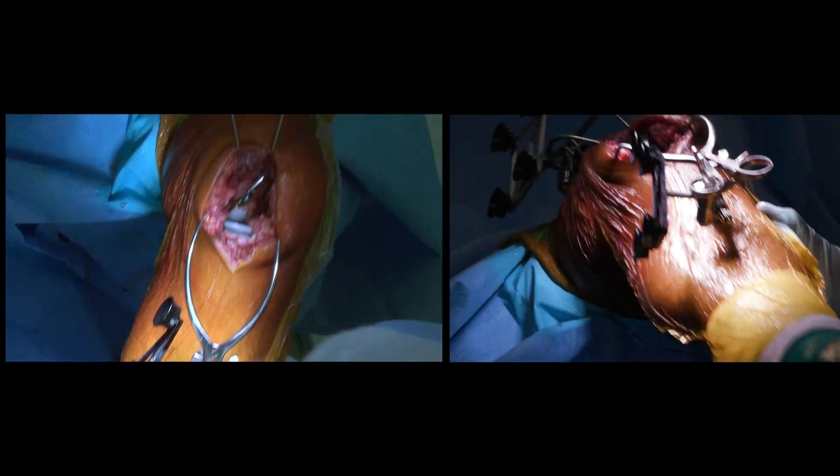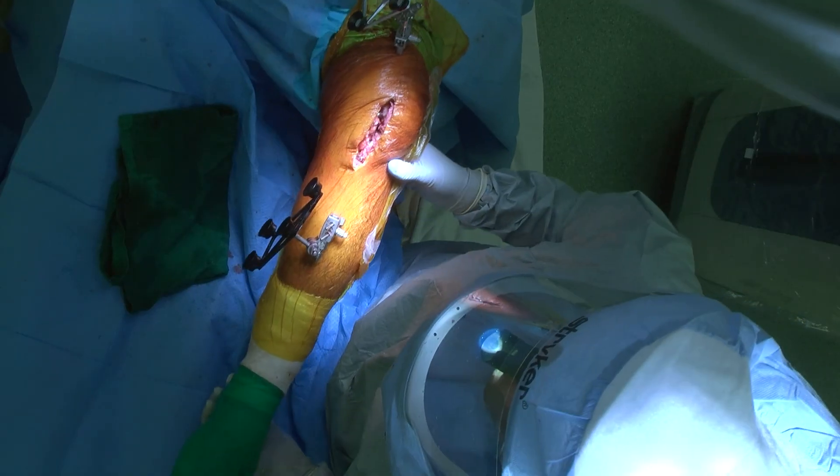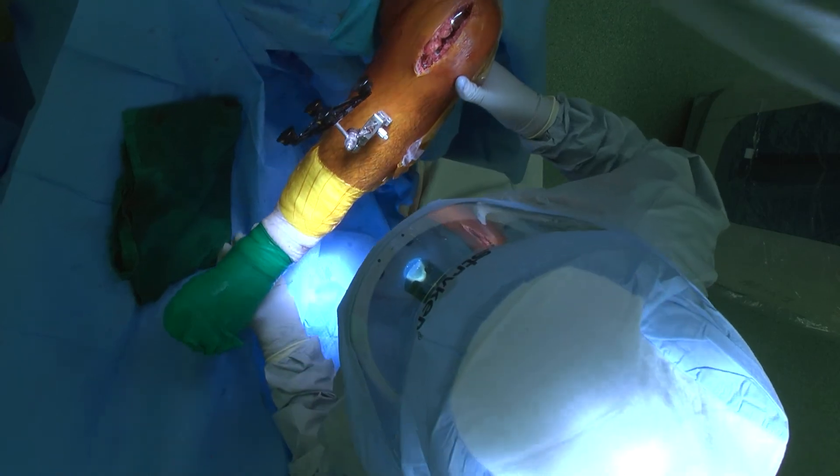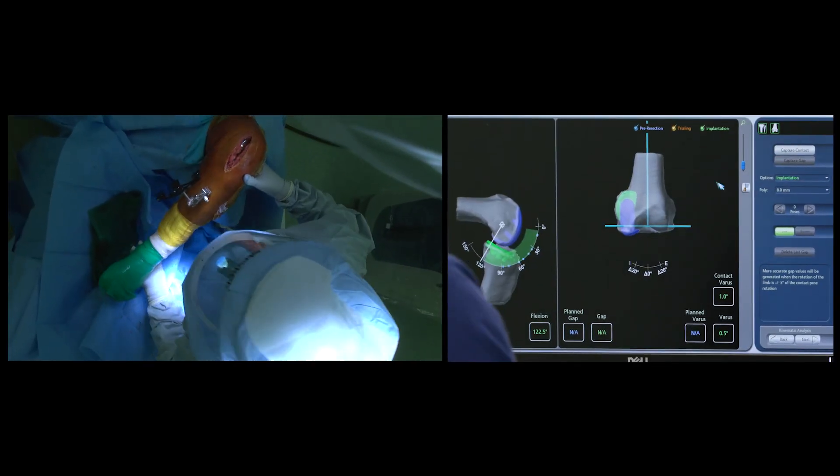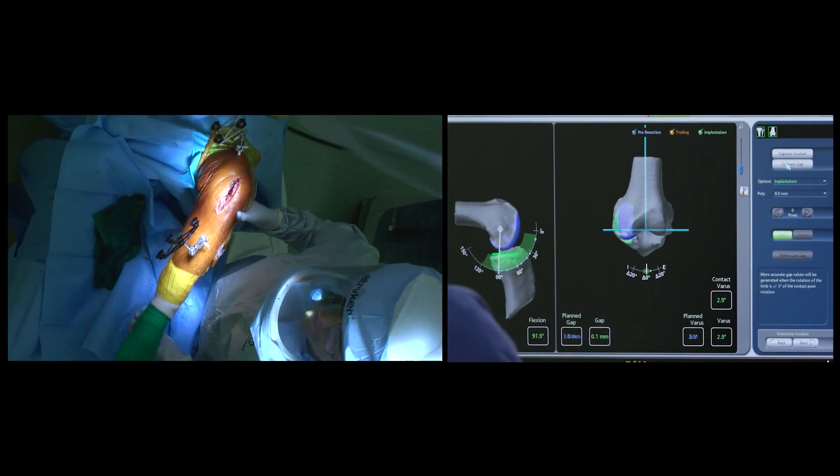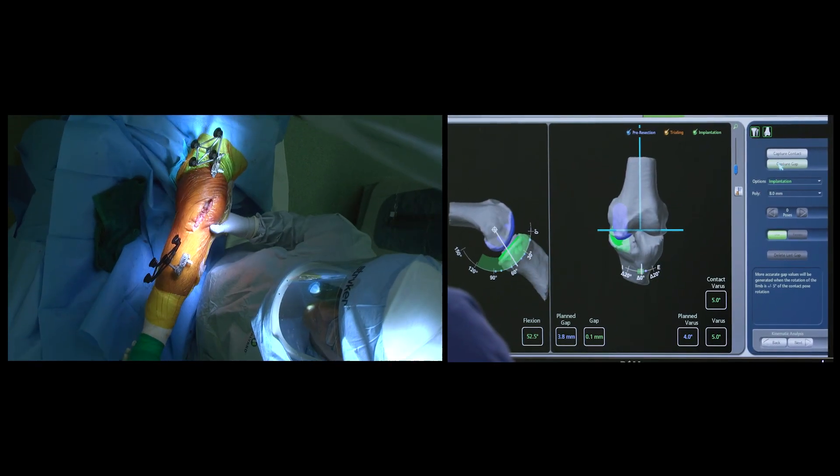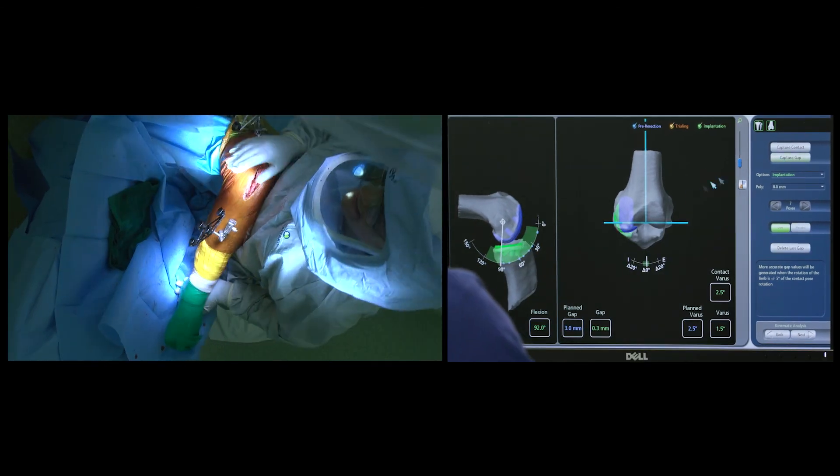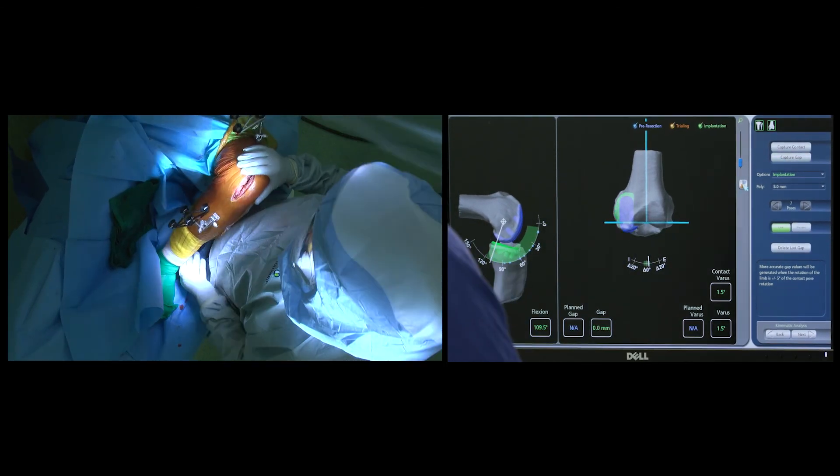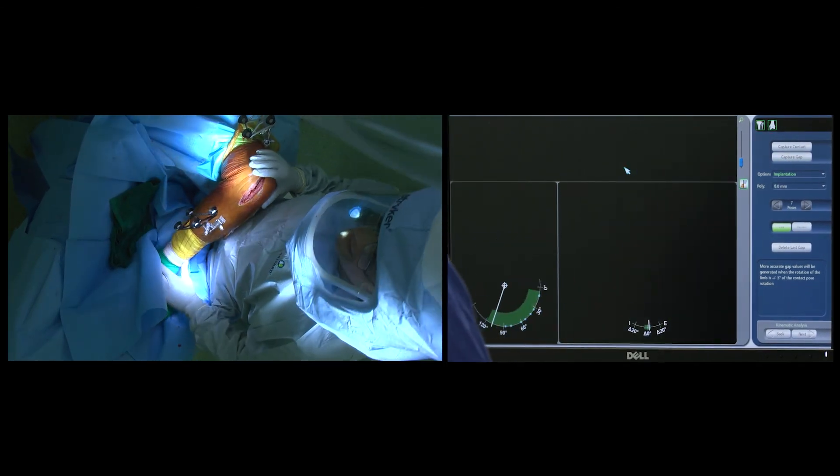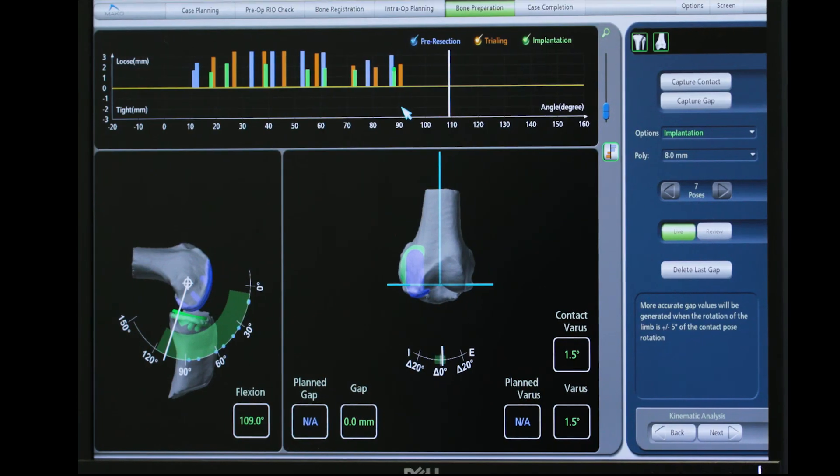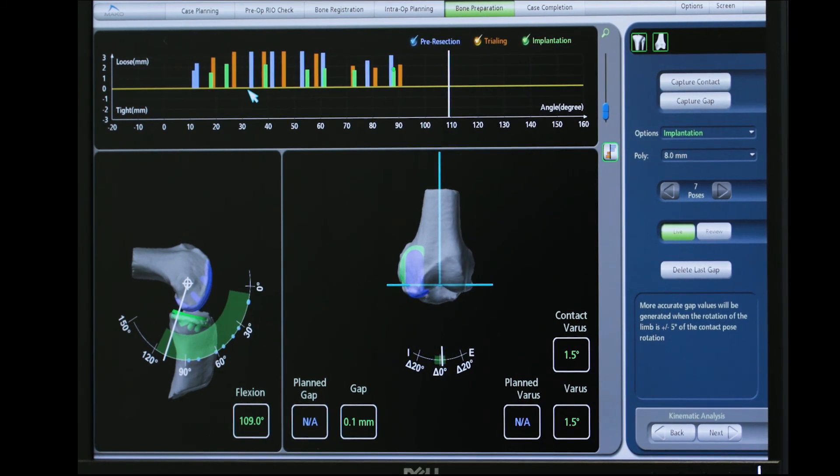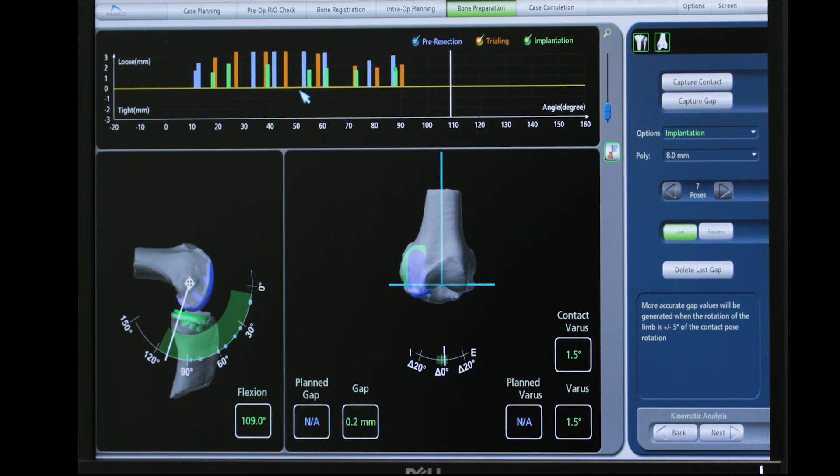The final check is made with the definitive implants in place to document the alignment, range of motion, and the soft tissue tension, and once this is completed the surgery comes to an end.